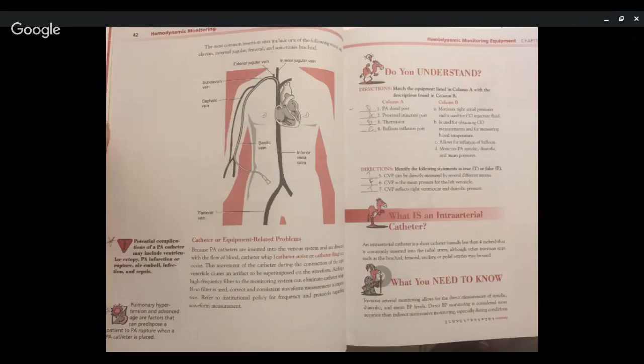What is used for obtaining cardiac output measurements and for measuring blood temperature? That has to be the thermistor. What allows for inflation of the balloon? The balloon inflation port. And what monitors the pulmonary artery systolic, diastolic, and mean pressures? The pulmonary artery distal port.